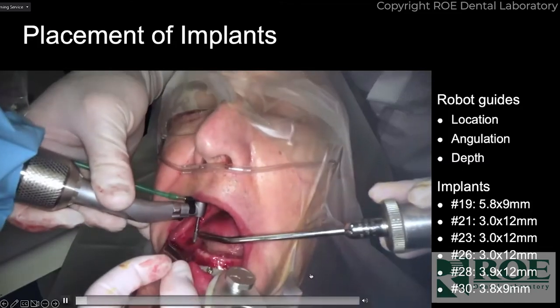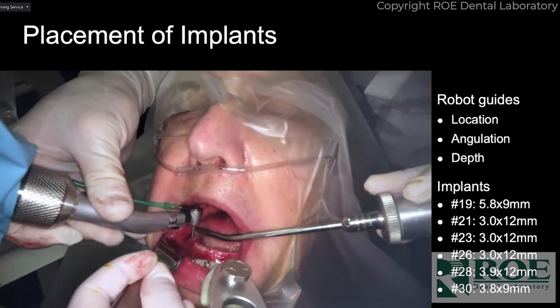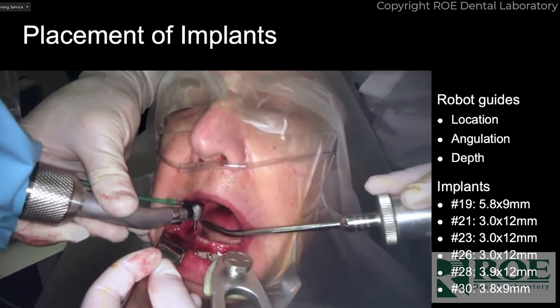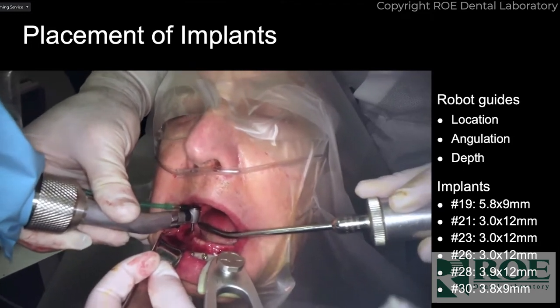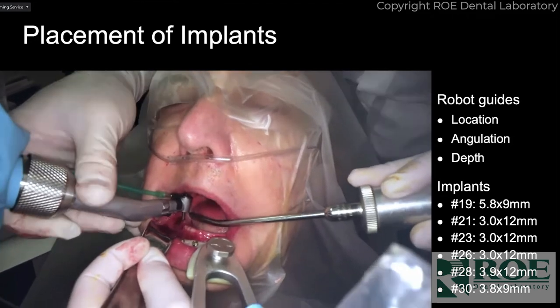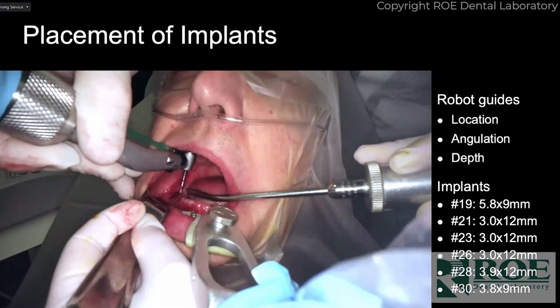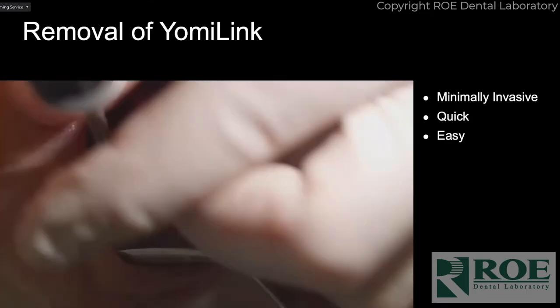Here's a video of me actually placing the implant — notice my hand is very loosely on that handpiece. It doesn't move; it stays put. That handpiece is not going to come out of position until she hits 'free' and then I can pull it out. Also notice that's a regular implant driver — I'm not having to go through a guide or use anything special or extra long. It's just your normal armamentarium.